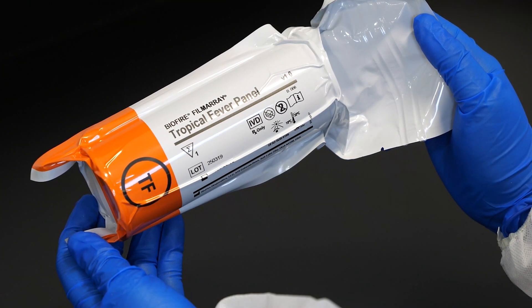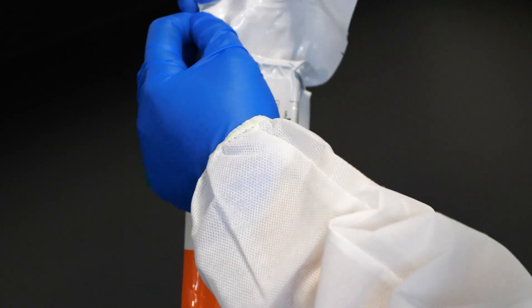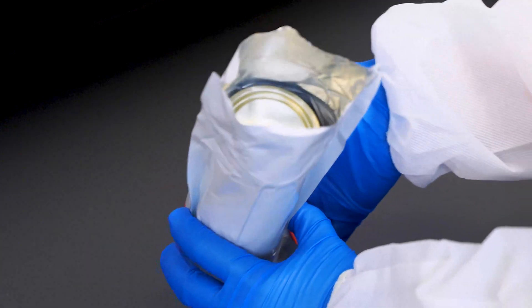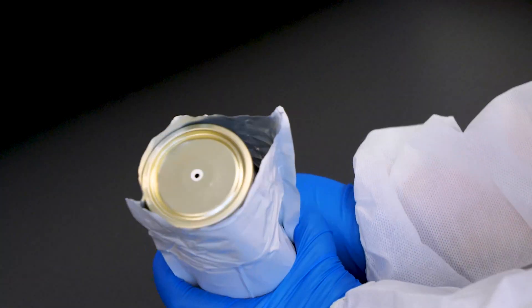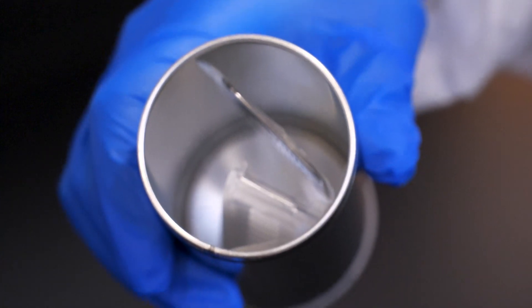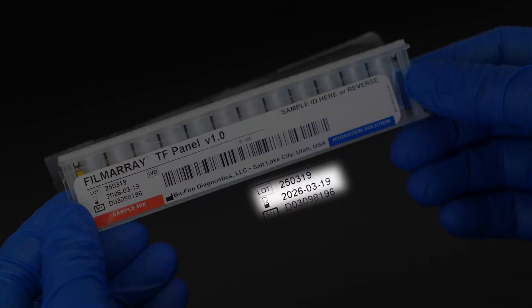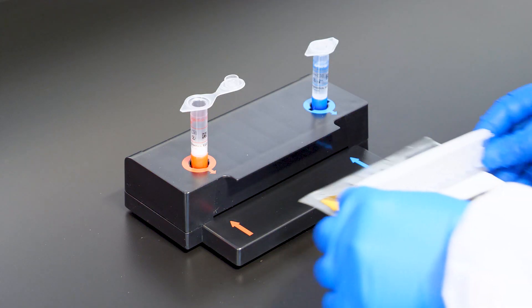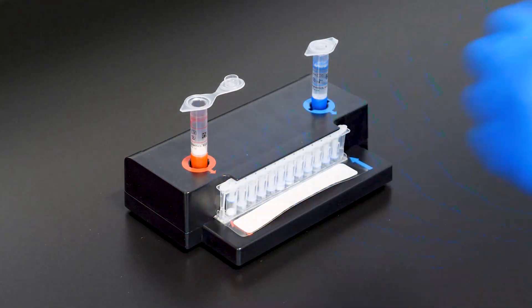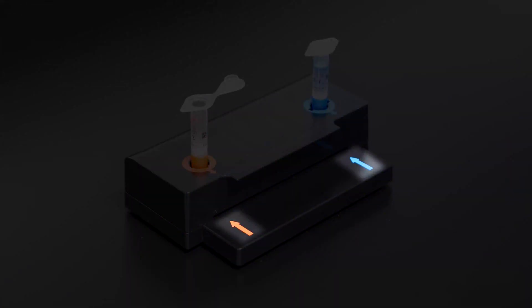To prepare the pouch, remove the pouch from its vacuum-sealed package by tearing or cutting the notched outer packaging and opening the protective canister. Check the expiration date on the pouch; do not use expired pouches. Insert the pouch into the pouch loading station, aligning the red and blue labels on the pouch with the red and blue arrows on the pouch loading station.